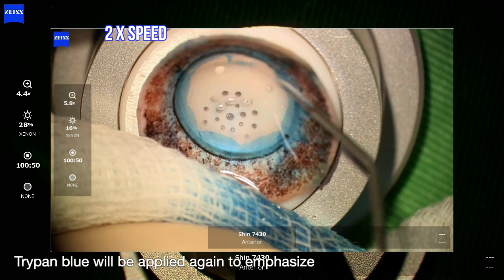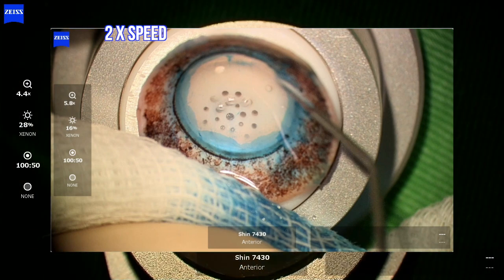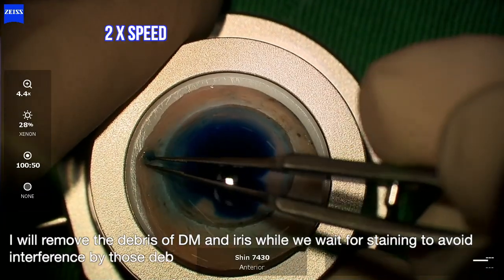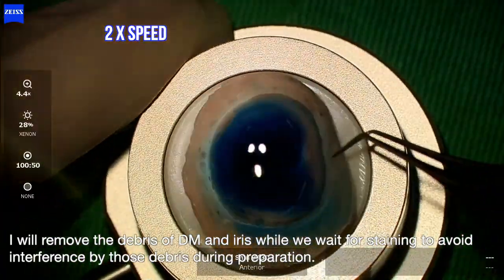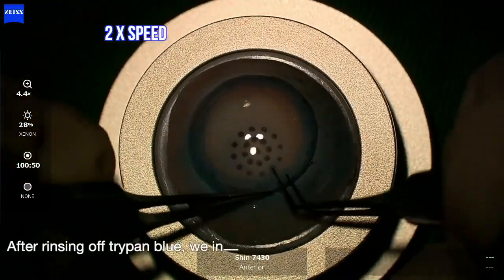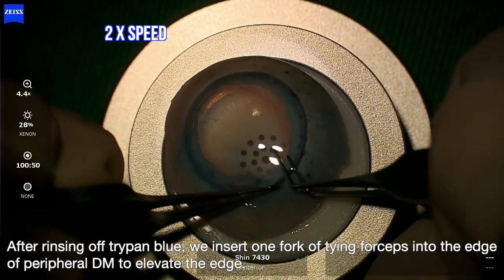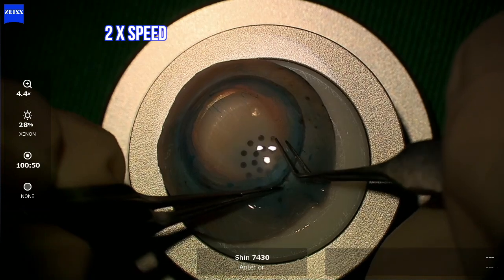Trypan blue will be applied again to emphasize the edge of the peripheral Descemet membrane. I will remove the debris of Descemet membrane and iris while we wait for staining, to avoid interference by those debris during preparation. After rinsing off trypan blue, we insert one fork of tying forceps into the edge of the peripheral Descemet membrane to elevate the edge.